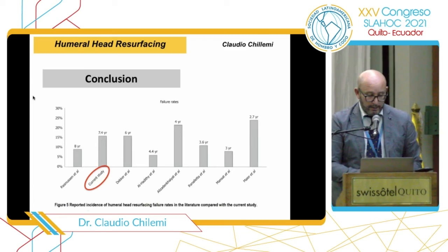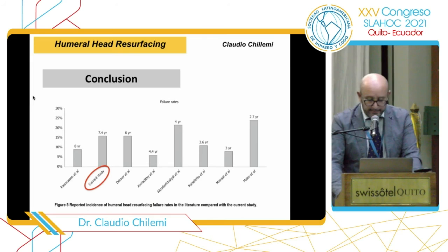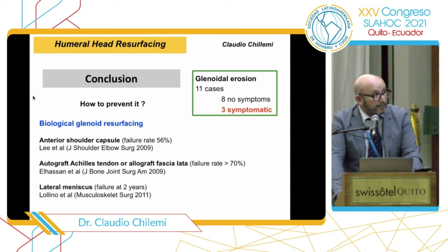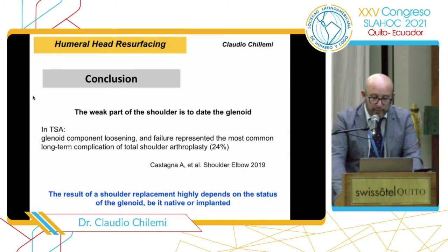If we have a look at the current literature, the reported incidence of humeral resurfacing failure rates compared with our study is similar. And the problem was the glenoid. In the literature, there were a lot of attempts to prevent glenoid erosion with a biological approach, and different tissues were employed: the anterior shoulder capsule, the Achilles tendon, the fascia lata, and the lateral meniscus. But all these attempts failed, because the reported failure rate was from 56% to 70%. So the weak part of the shoulder, we can conclude, is the glenoid.